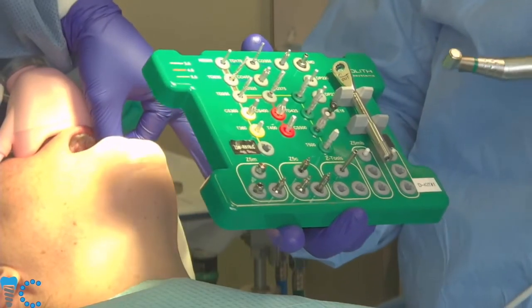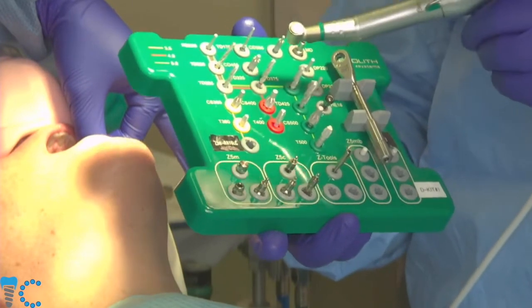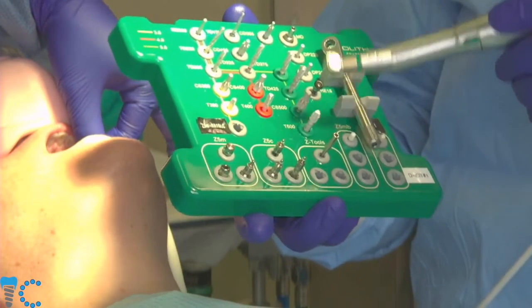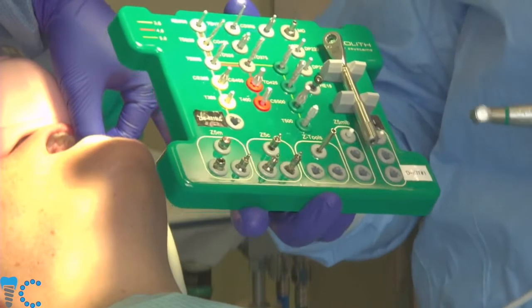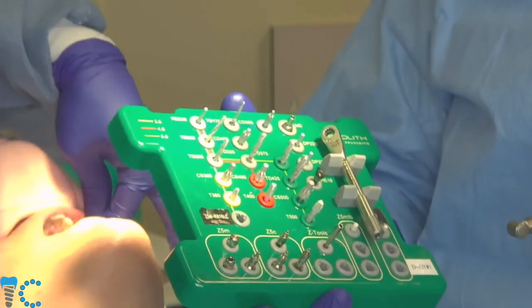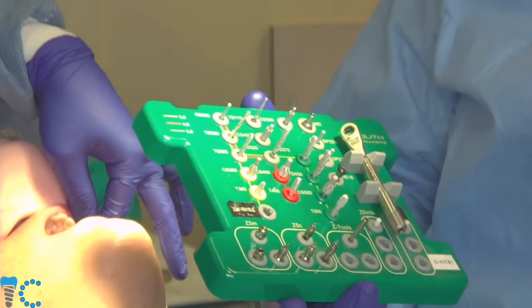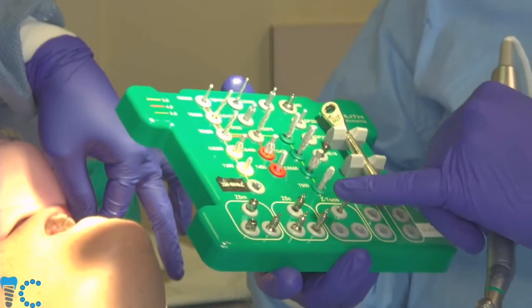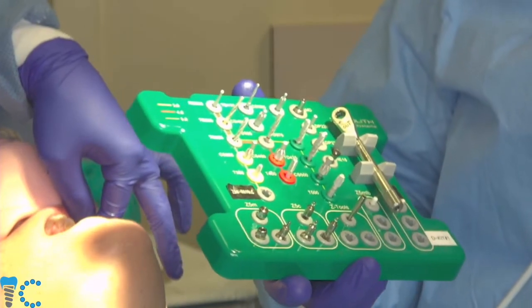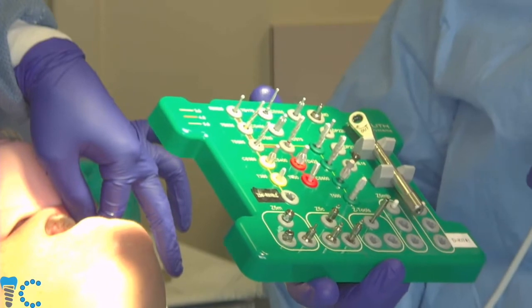If we were going to place a 5 millimeter diameter implant, the first 3 drills we'd use the same. We follow the green line, and we would go 2 more twist drills up before we finished off our osteotomy. We also have a couple paralleling pins in here. We have implant placement instruments in here, and a drill extender in here that we'll use.